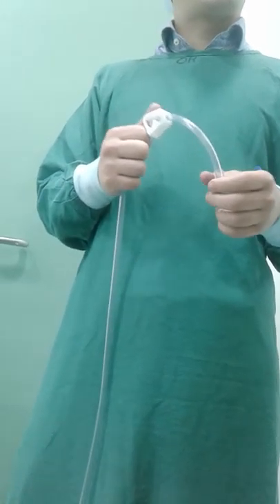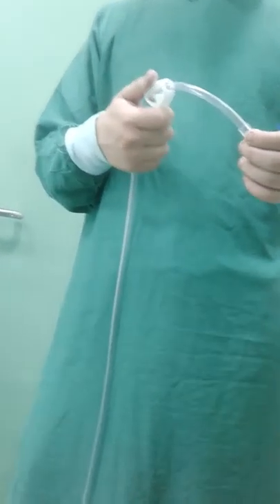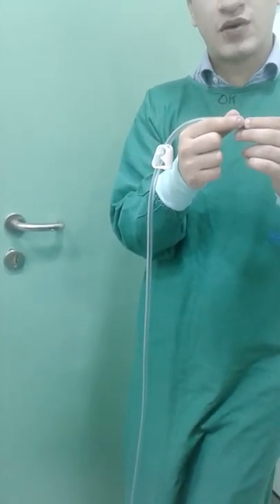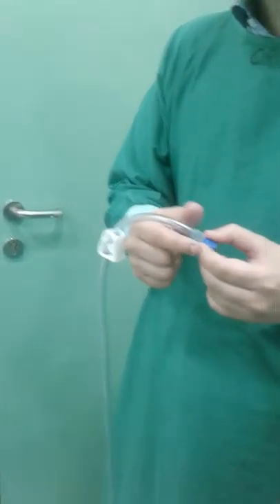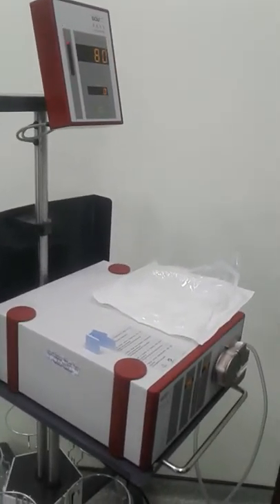Do you supply this with the hysteroscope, or is it purchased separately? No, I think we supplied the hysteroscope. And you connect this to the inflow port of the hysteroscope for the irrigation. Yes, the irrigation. It is like the endoscopes, this is for the scope. It is like the suction irrigation pump. Suction irrigation pump is there. But this is only for irrigation, not the scope. Okay. Fine.